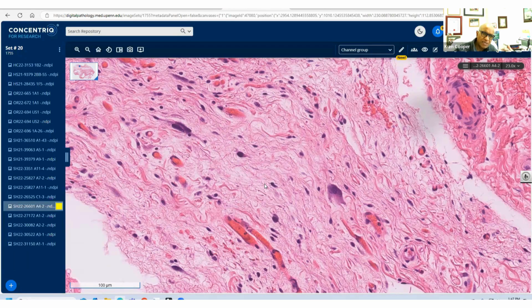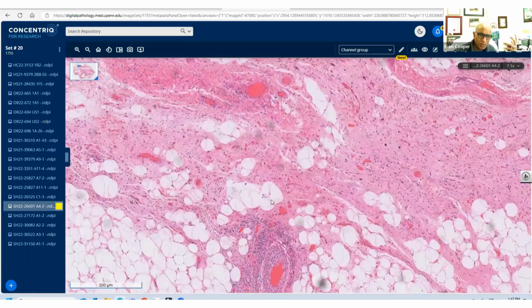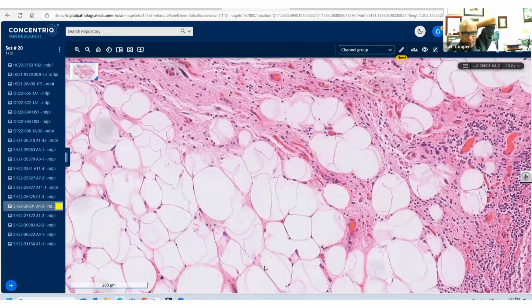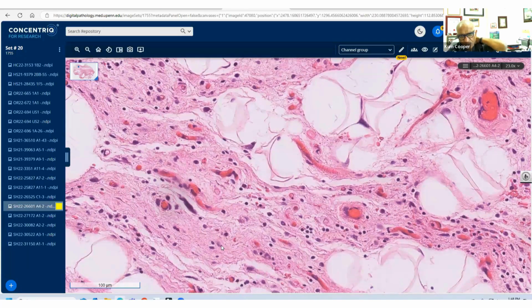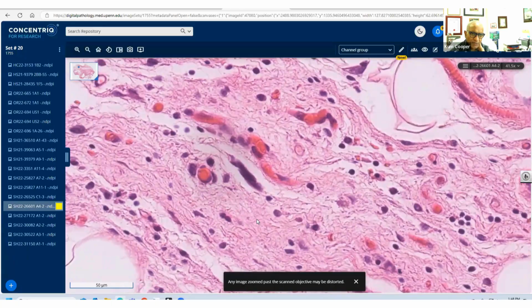Your next step then is to ask, well, what is it? And your first question would be, could this be an atypical lipomatous tumor? Now, remember earlier I said the well-differentiated liposarcomas in the extremity, we call them atypical lipomatous tumor. I'll abbreviate that as ALT, okay? So we call them ALTs, and to confirm that diagnosis, you have to prove something, and the proof is in the amplification of chromosome 12, which is a giant ring chromosome, and if you have an antibody, you can show overexpression of MDM2 in the nucleus, in the atypical nuclei.